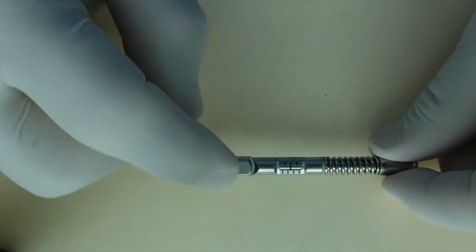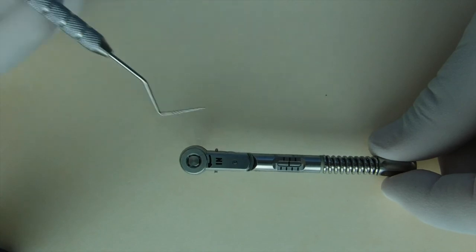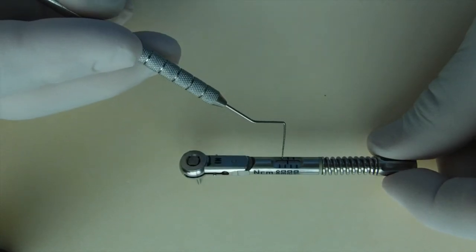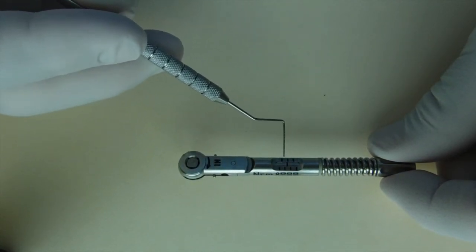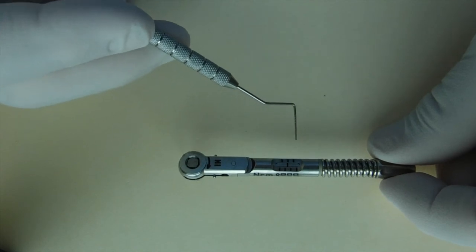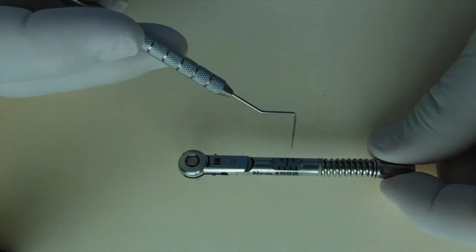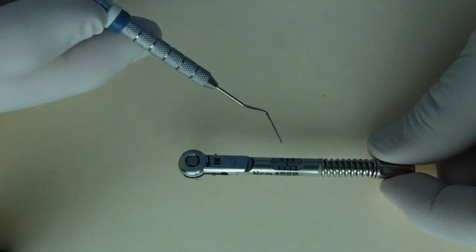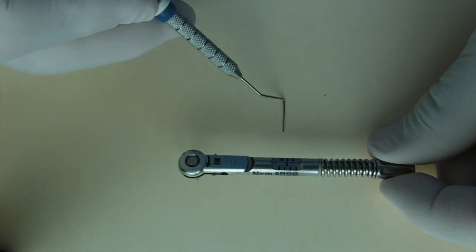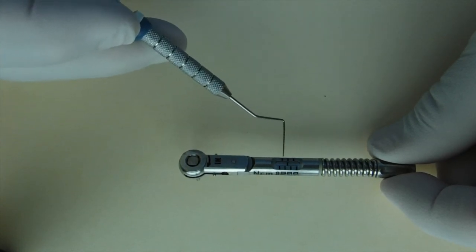It's very important that you verify that the torque wrench is set for the desired value of torque that you intend to use it for. Never assume that the person that used this prior to you has left it where you may intend to use it. It's very important.